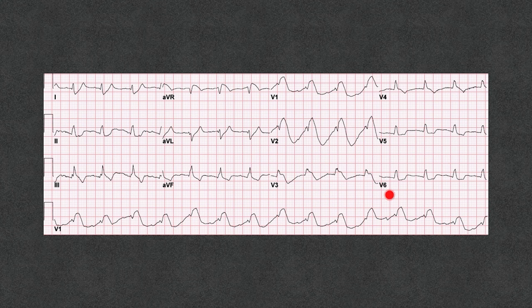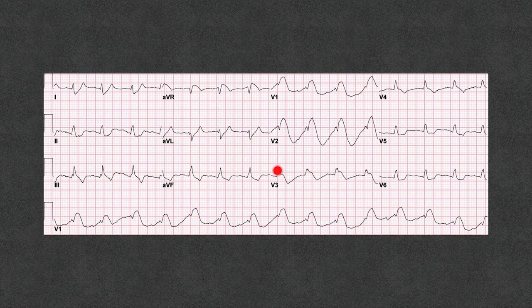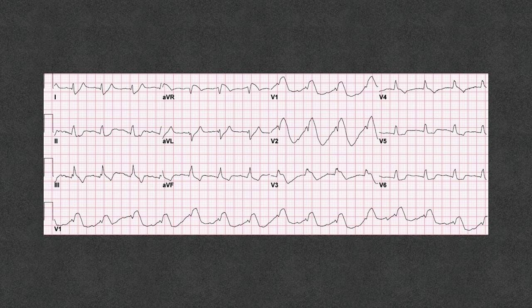This EKG shows a really bizarre QRS — I cannot distinguish the elements of the QRS complex, and there may be P waves embedded just before the QRS. There appears to be ST elevation as well. Whenever you see this kind of EKG, think of hyperkalemia, because hyperkalemia can mimic STEMI. If STEMI is suspected, activate the cath lab, but I would also start treatment for hyperkalemia immediately. This patient's potassium came back at 8.